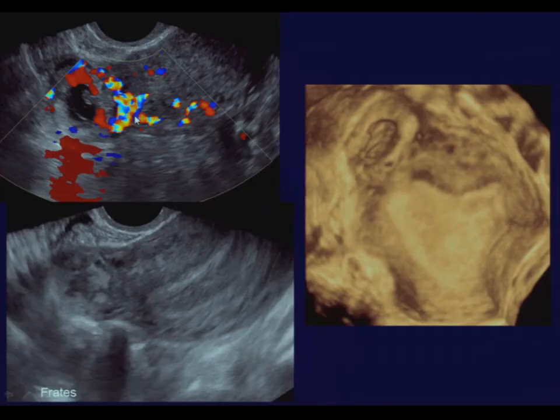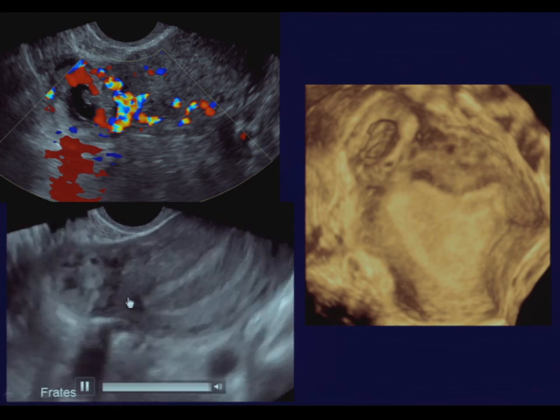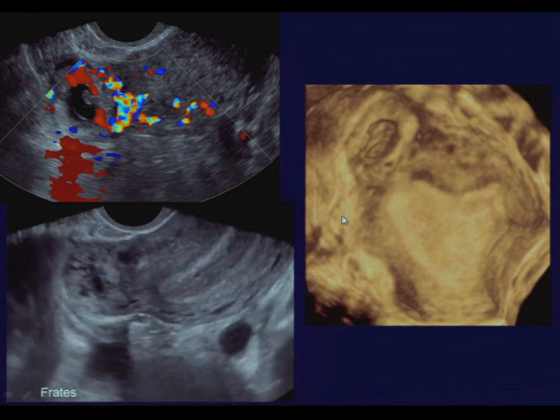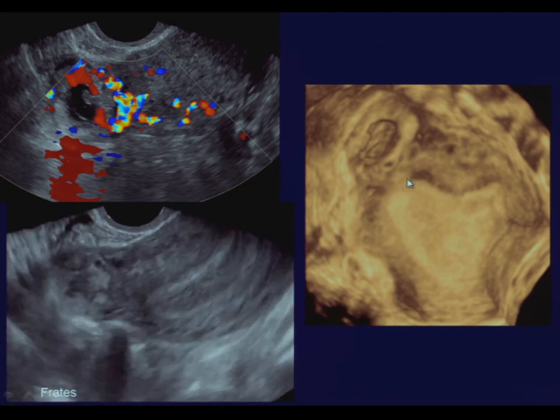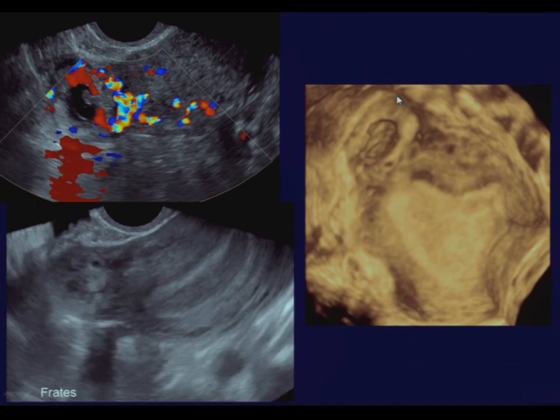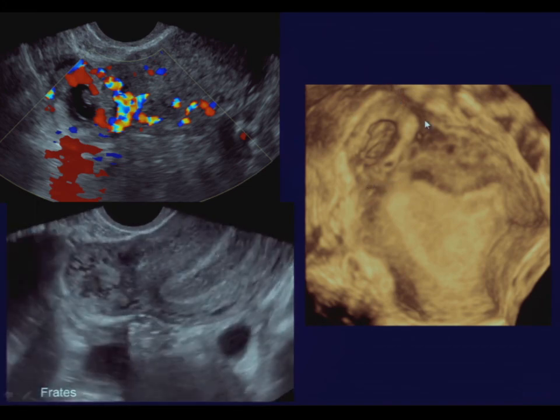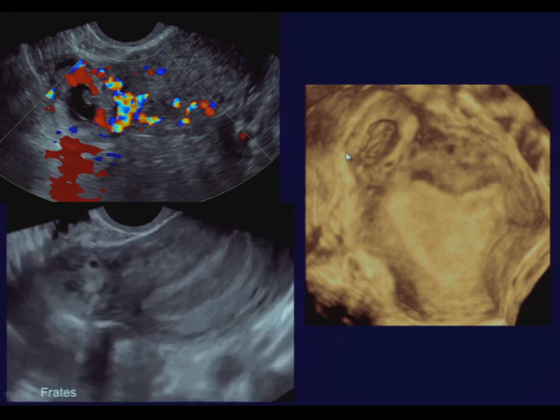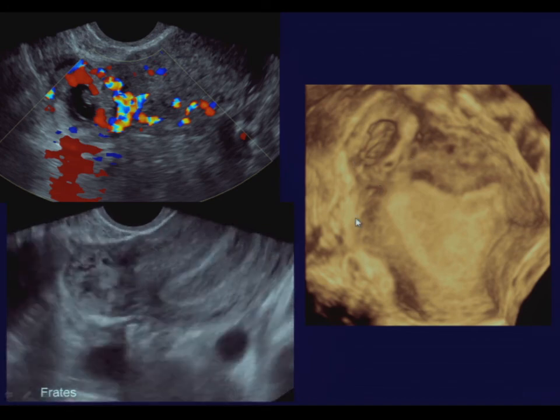Lots of flow around the gestational sac. When we push on the sac, you can see that it does not separate off from the uterus, but the answer really is clear on the rendered view, where we can see that the endometrial cavity ends and this gestational sac is sticking far out into the side. It is indeed an interstitial or cornual ectopic pregnancy, and the myometrium is not intact over the top of it.